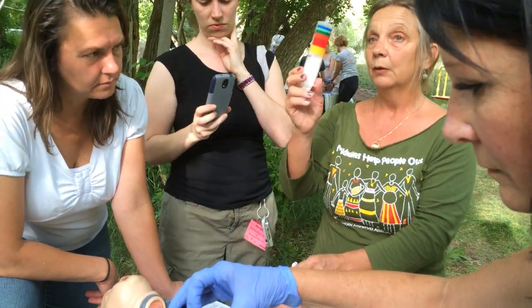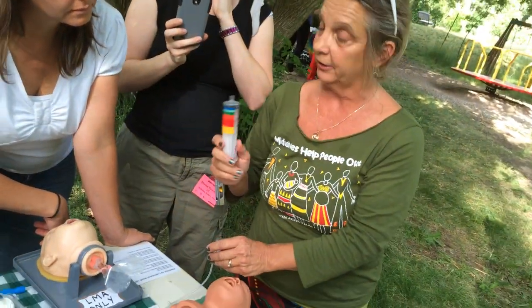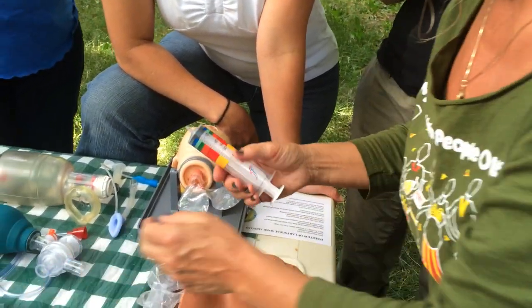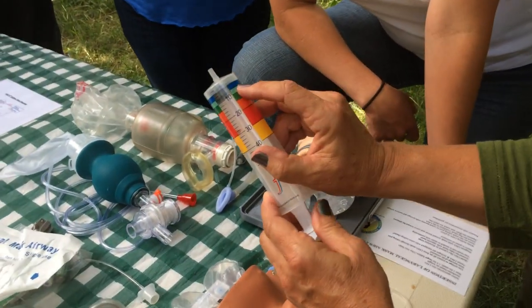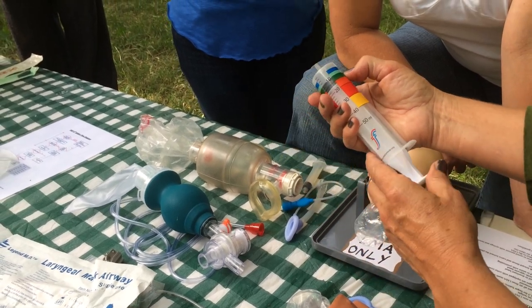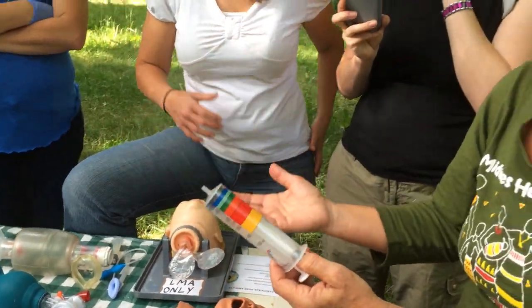So, when you get them, you need to have a syringe that has no air in it. It doesn't matter what kind of syringe, any size, shape, syringe that you have. So this one is graded because this works with a number one. This works with a blue number 1.5. That's how much air you would use to fill it. So this is just a graduated syringe for that purpose.